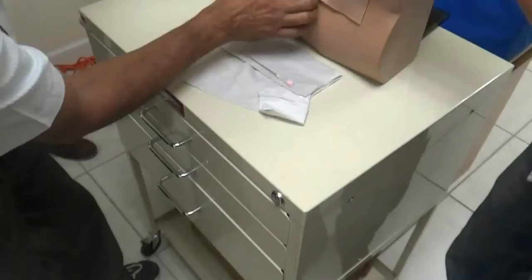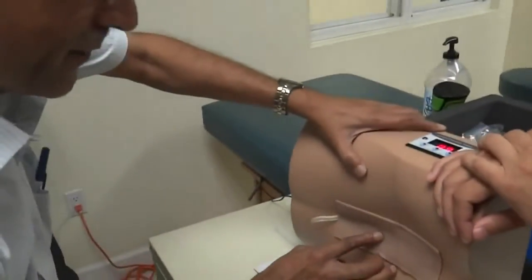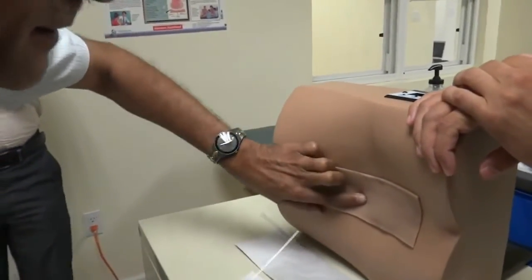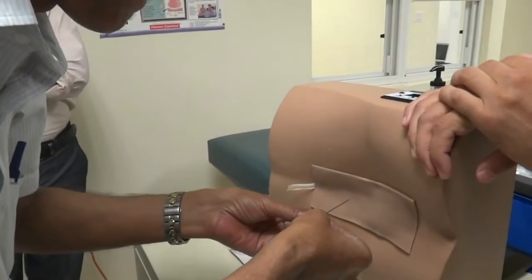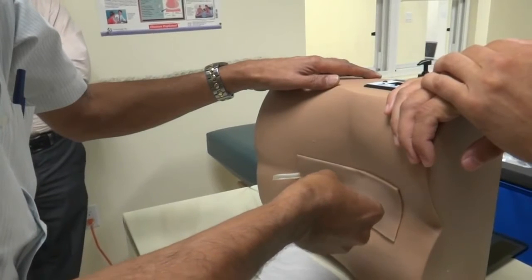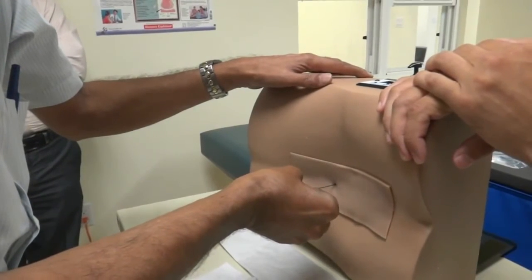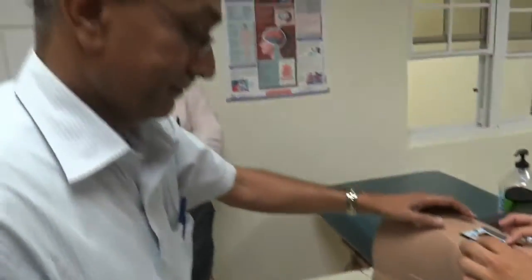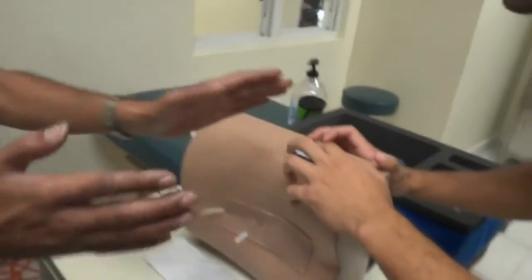This is the procedure. You've recorded it, so you can see the procedure. Trying to go through L2-L3. Look at the precision. He got it — first try. That's because I've got a general idea which axis to take. I did it! Because I'm standing there and I'm guiding your finger. So I know which axis to take.